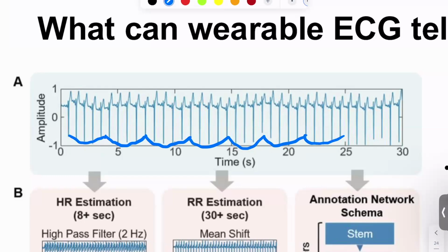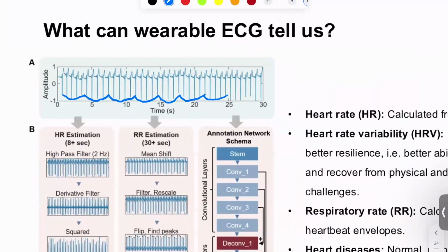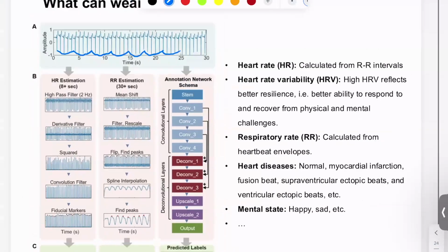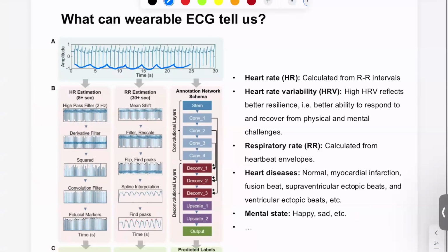Go ahead. Does it have to do with the movement of your chest or no? You are very close. Can you explain in more detail? Like your lungs are expanding? Yes. And then that could affect the electrical impulse. Yeah, you're right. Oh, go ahead. Is it because the lungs move the heart closer to where the electrode is?